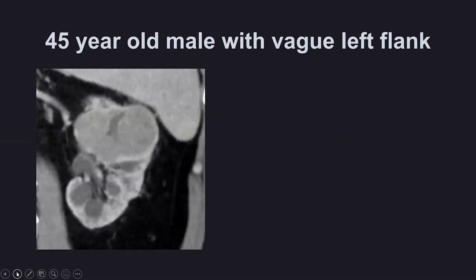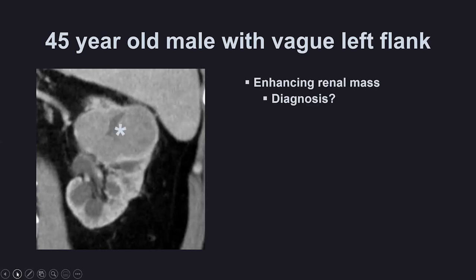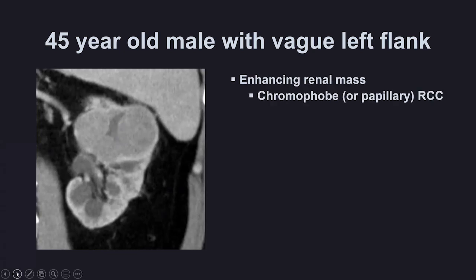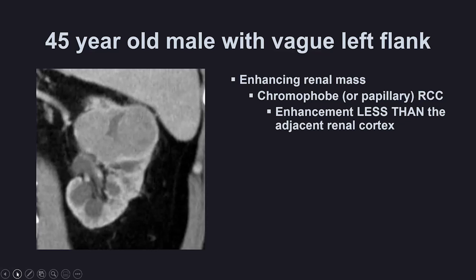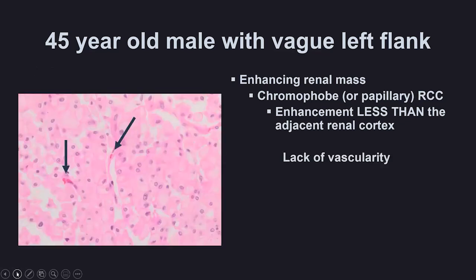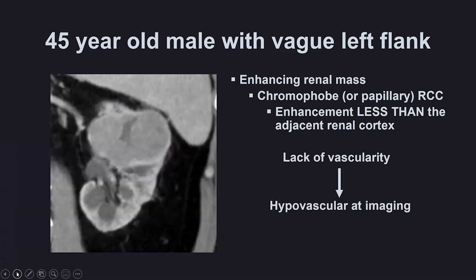The last case: a 45-year-old male with vague left flank pain and an enhancing renal mass on CT. The diagnosis here is chromophobe or papillary RCC, not clear cell. Notice that the enhancement is less than the adjacent renal cortex. Chromophobe and papillary RCC both have much less vascularity than clear cell RCC — very little vascularity. Lack of vascularity under the microscope means hypovascular imaging. That is why chromophobe and papillary RCC have enhancement less than the adjacent renal cortex. Thank you very much for your attention.